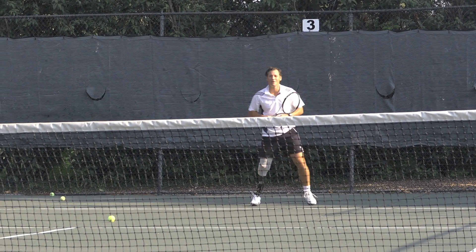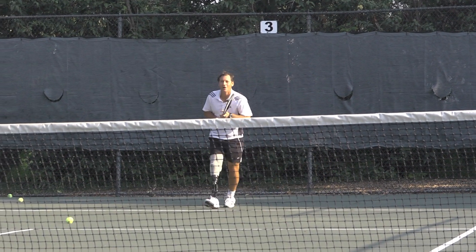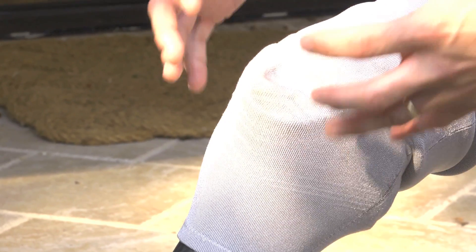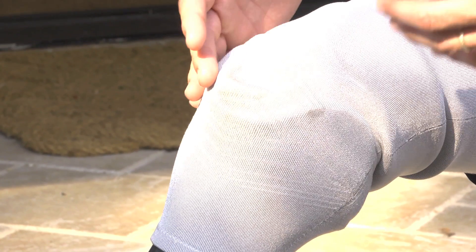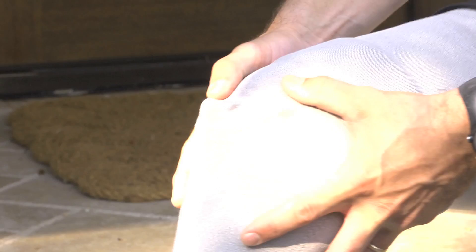With amputees getting more and more active, I want to take a couple minutes to talk about sport-specific prostheses. With any sport-specific prosthesis, you're going to want a very securely fit socket. This one in particular is a suction socket, so it's held very securely and minimizes the amount of friction and pistoning inside the socket.